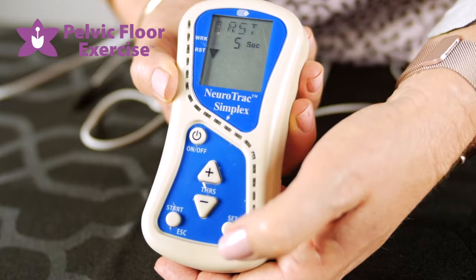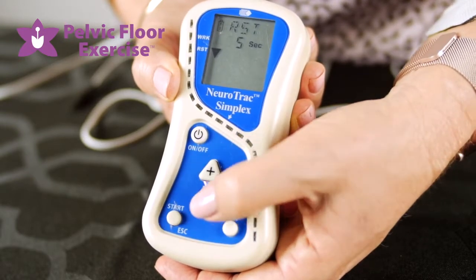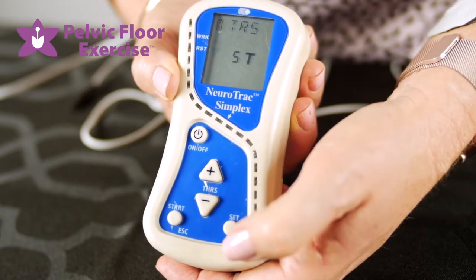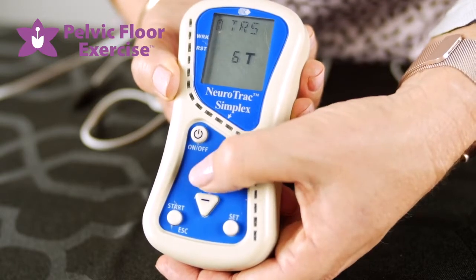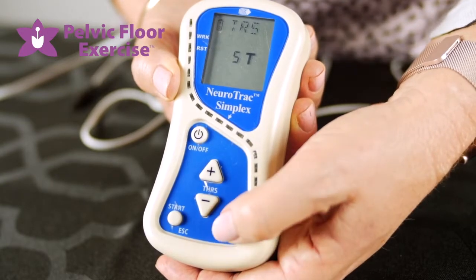Pressing SET again, we have the rest time — if we've got five seconds here I might want to increase that rest. Press SET again and the T comes up, which is the number of trials — how many repetitions you want. You can use the minus and plus buttons to change the number of repetitions for this particular program.